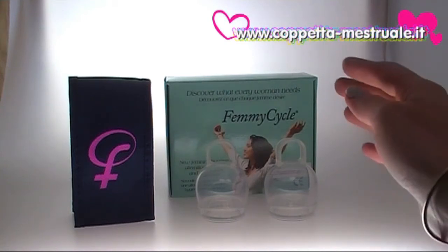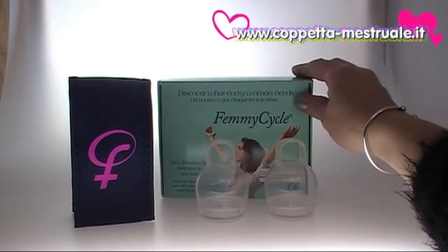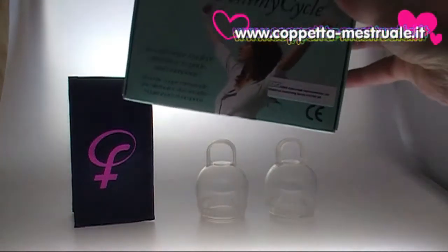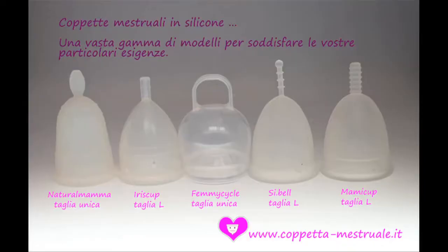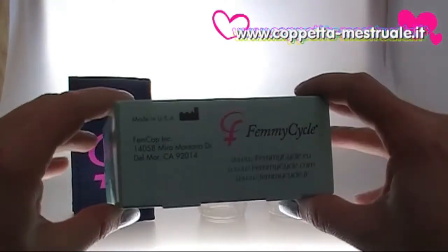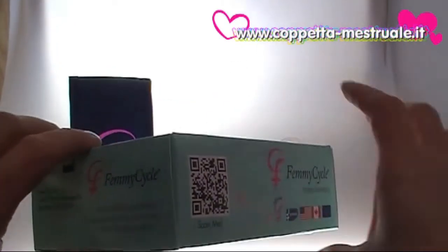Hi, welcome to my video review of the Femicycle menstrual cup. The Femicycle is a menstrual cup for a new generation of women. It has a totally different design from any other cup available today. It comes in a twin pack and is made in the USA by the Femcap Company.